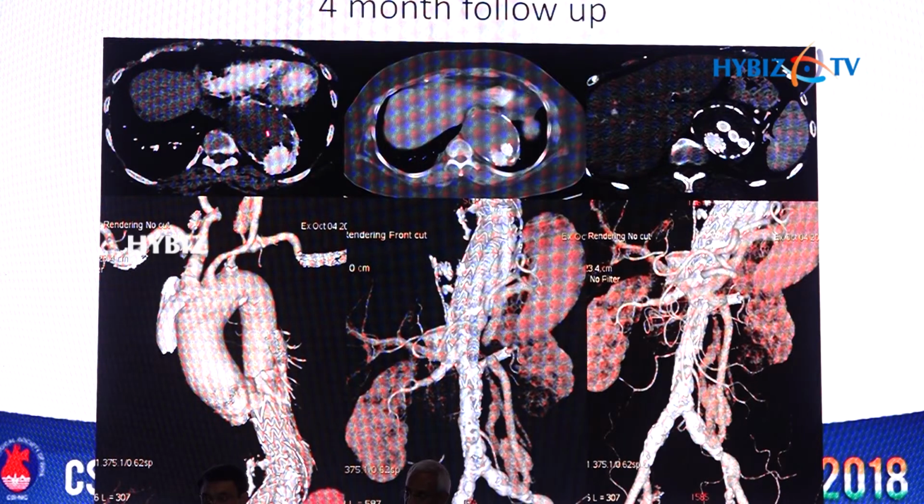The upper panel CT shows aneurysm at various levels. This is the Endurant main body. This is just after the flow divider. It's actually not projected clearly, but you could appreciate a Mercedes-Benz sign. The three grafts entering the visceral arteries have nicely conformed in a triangular shape within the bifurcation limb.